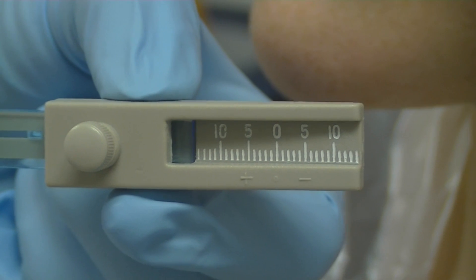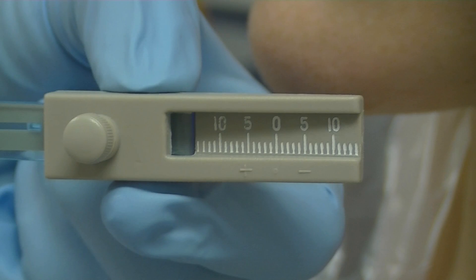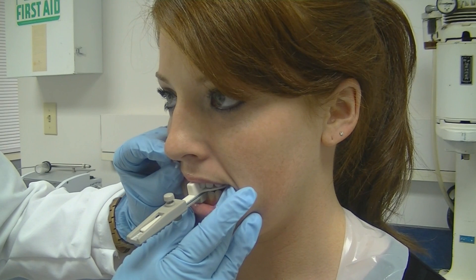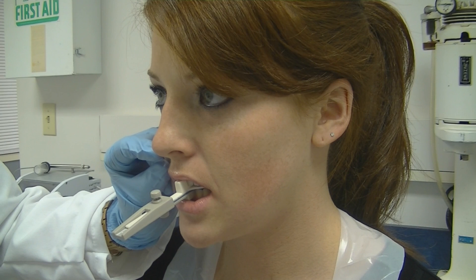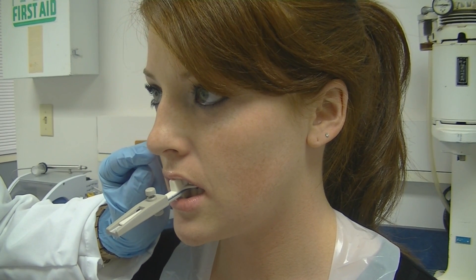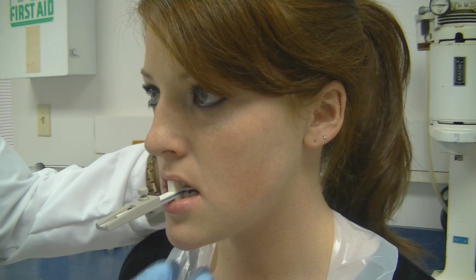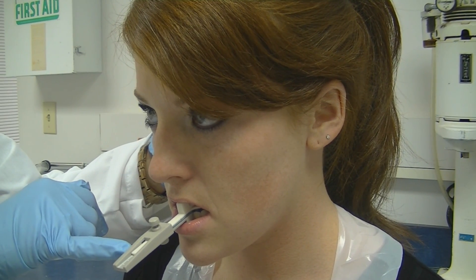You will notice on the gauge itself a plus and a minus that is even with a 0 to 10 scale on both sides. Keep in mind when the patient has the fork in the mouth and they are moving back and forth to get to the full protrusion and the normal bite, the plus sign indicates the protruded side and the negative sign indicates the normal bite.